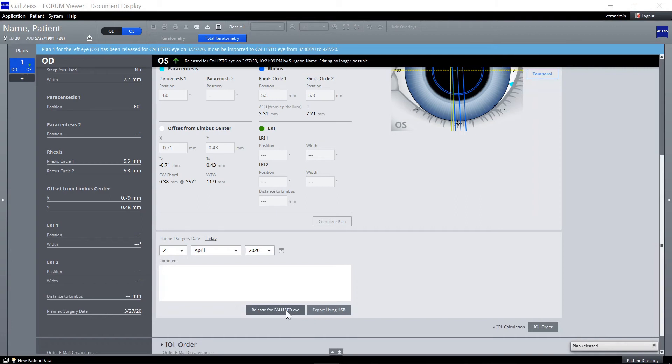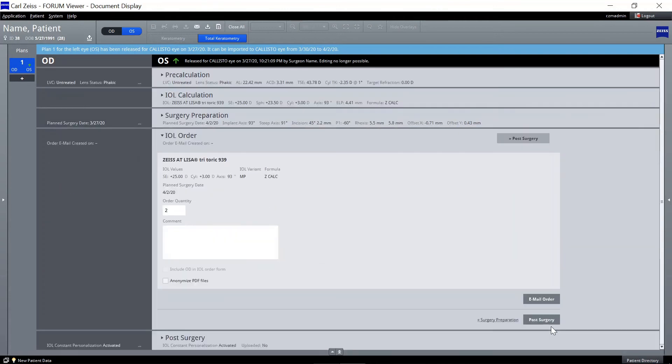Click on IOL order if you would like to order the selected IOL via email. On the IOL order screen, review the planned IOL and surgery date and adjust the number of IOLs to be ordered if necessary.